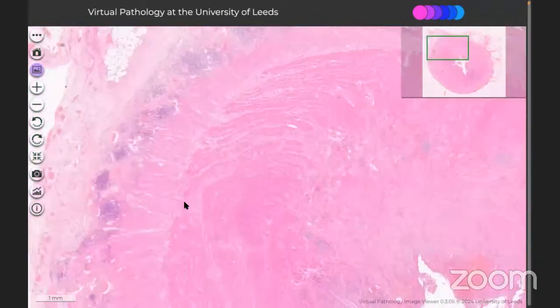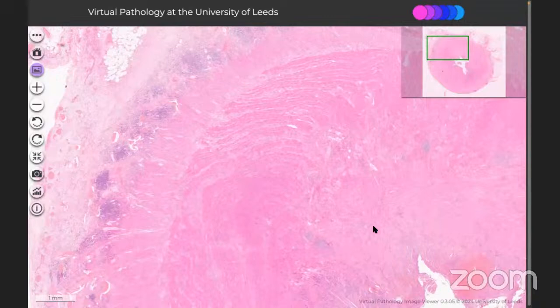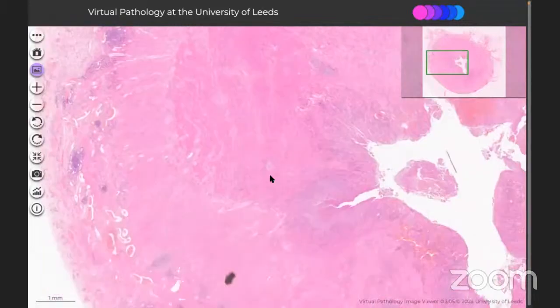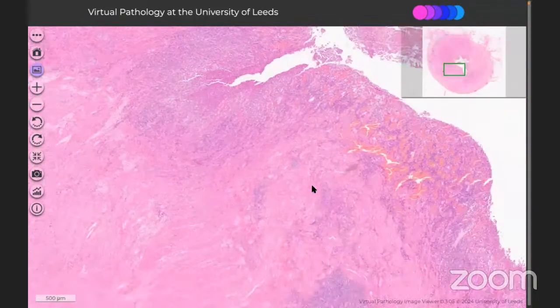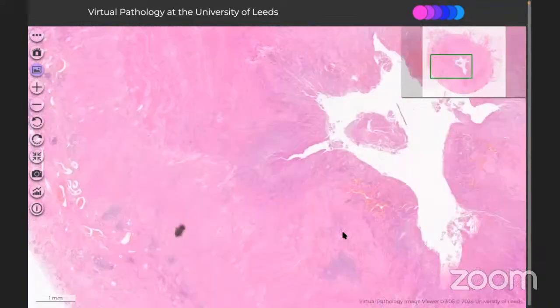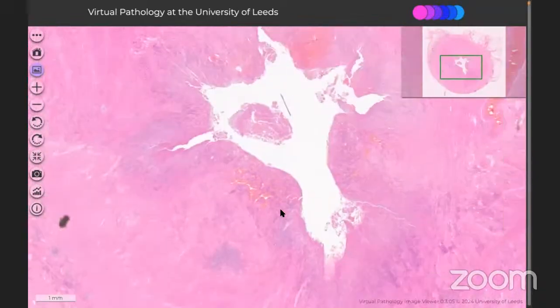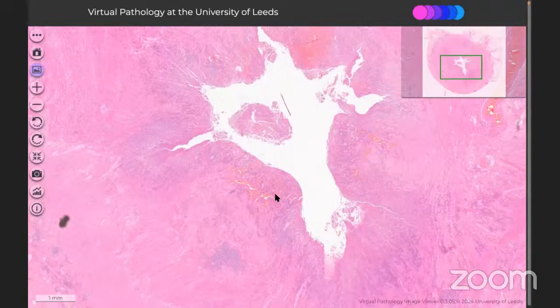So with the history that the patient is having a small bowel stricture, lymphoid follicles, increased fibrosis, increased non-caseating granulomas, and fissure ulcers are pointing towards the diagnosis of Crohn's disease, inflammatory bowel disease. That is Crohn's disease, likely or definitive for Crohn's disease. Okay. So now how will you work up this case?